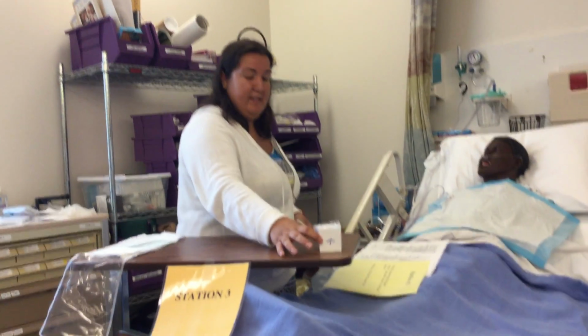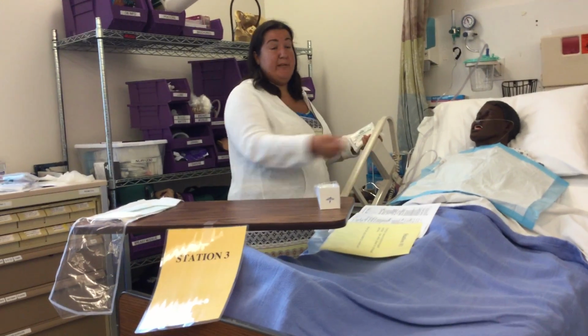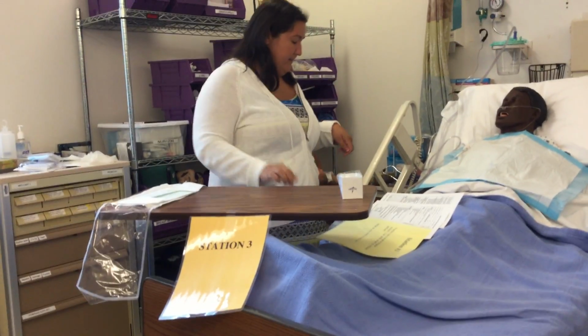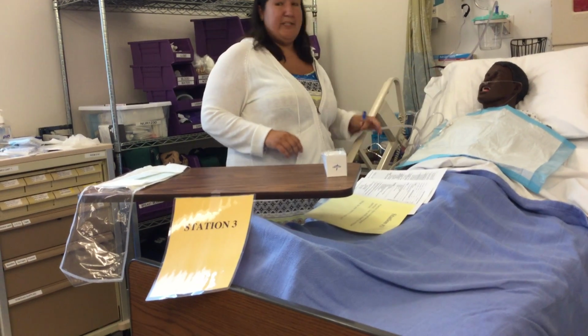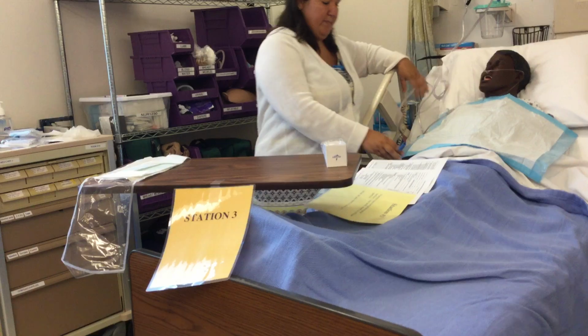You probably want your box closer to your patient because you're going to have to reach the suction catheter, so you're not doing this kind of thing. You want to keep your eye on your patient because it's your sterile field. So I've got everything set up. I want to get this close to me because I'm going to contaminate one hand. Again, I don't want to be reaching all over with one hand sterile, so I have this close by me right here.